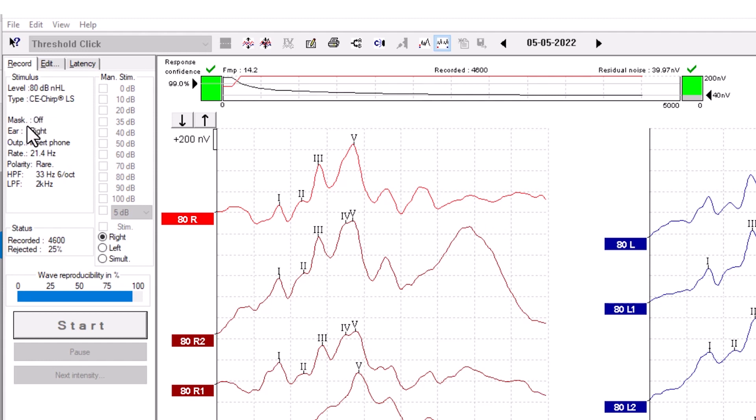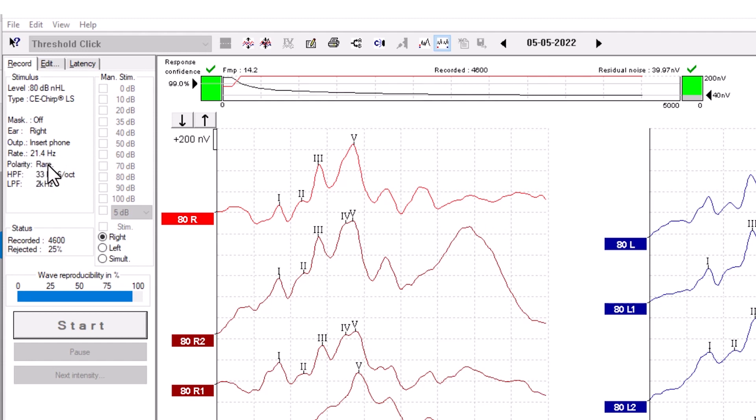You can see whether masking has been used or not. You can see what ear has been tested, what transducer has been used, the stimulus rate, and the polarity. And you can see the high-pass and low-pass filter settings.